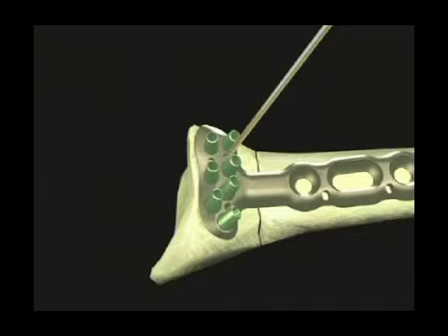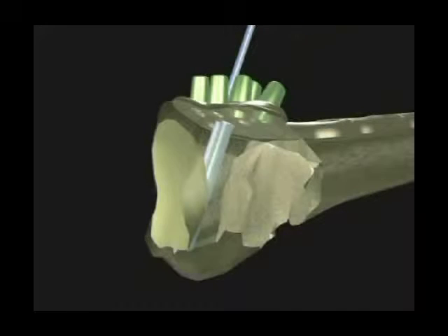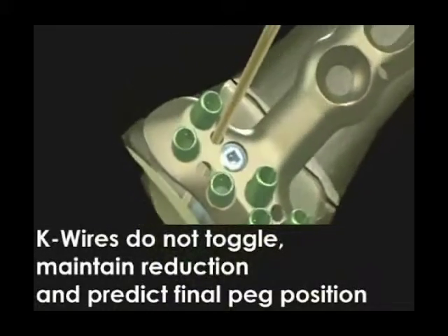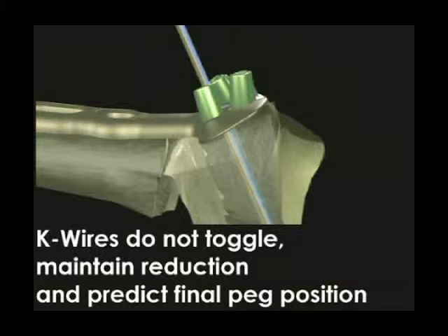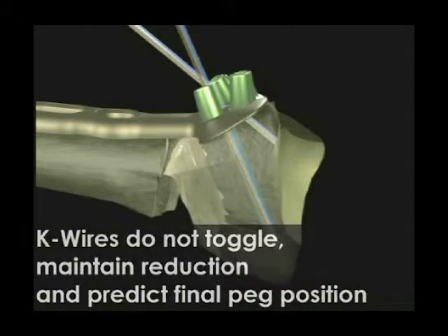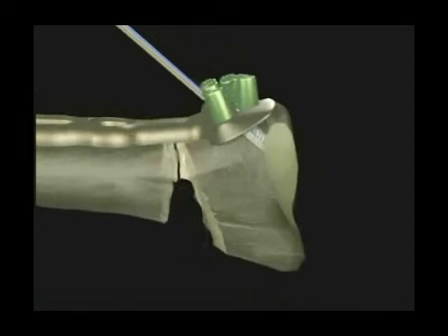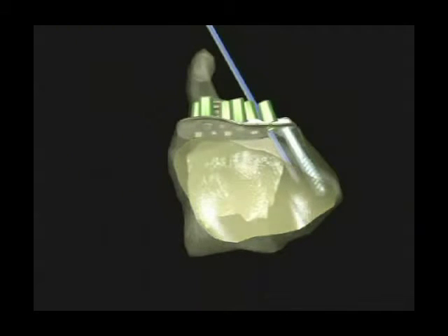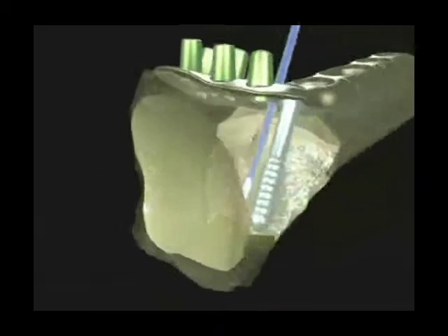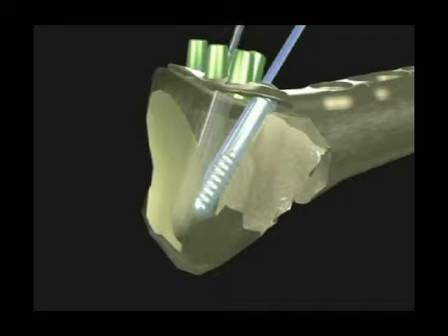After final reduction has been obtained through indirect means using the DVR anatomic as a template, secure the distal fragment using a K-wire through the hole on the ulnar side of the proximal row. A second K-wire can be used on the radial side of the proximal row when extensive comminution is evident. Confirm proper reduction and placement of the K-wire 2 to 3 millimeters proximal to the subchondral plate using fluoroscopy and 20 degrees elevated lateral views.